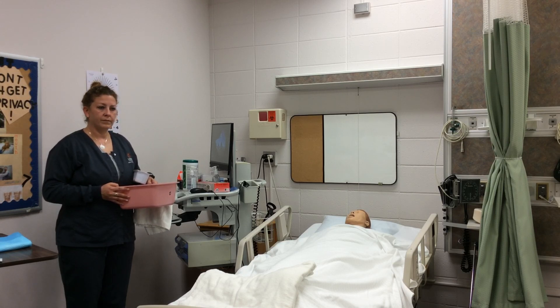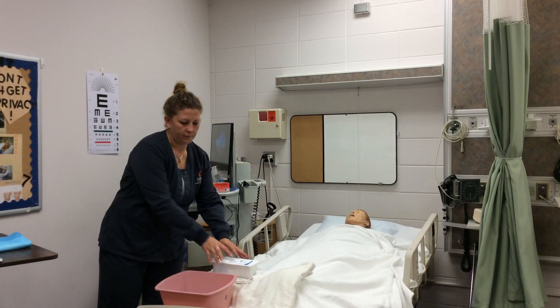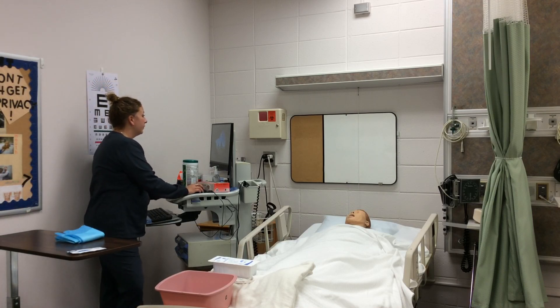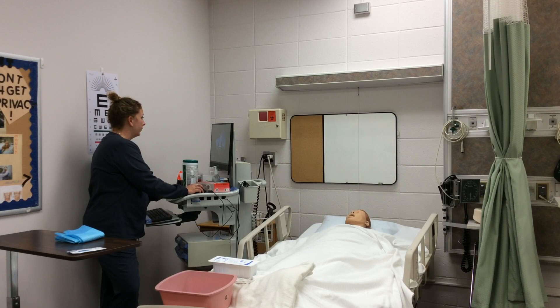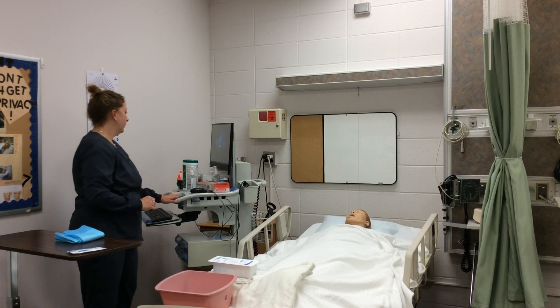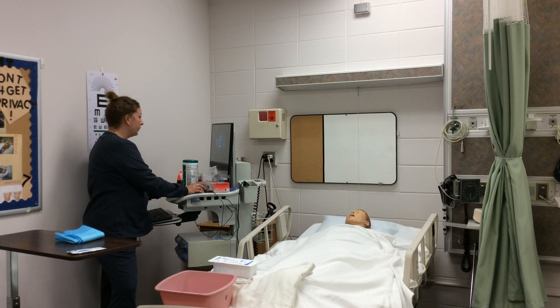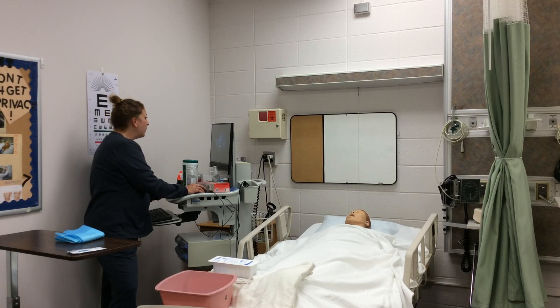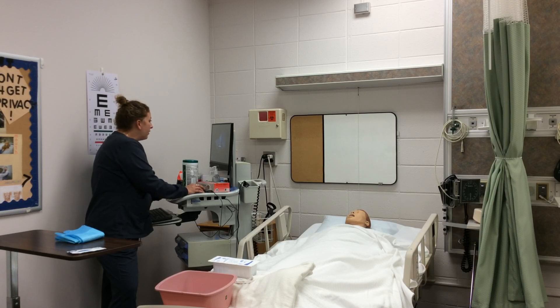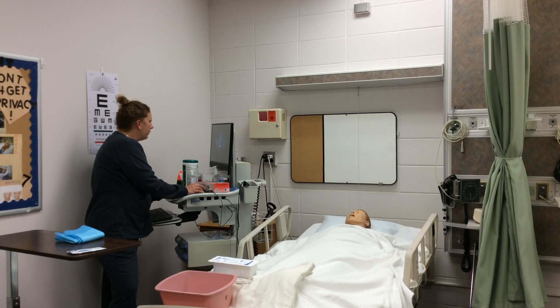Sarah will start by verifying the healthcare provider's orders. She has verified the order. She will review the patient's medical history for pathologic conditions which may hinder the procedure — looking for any history of BPH, difficulty with catheter insertion, urinary strictures, or urethral surgery. She finds none.